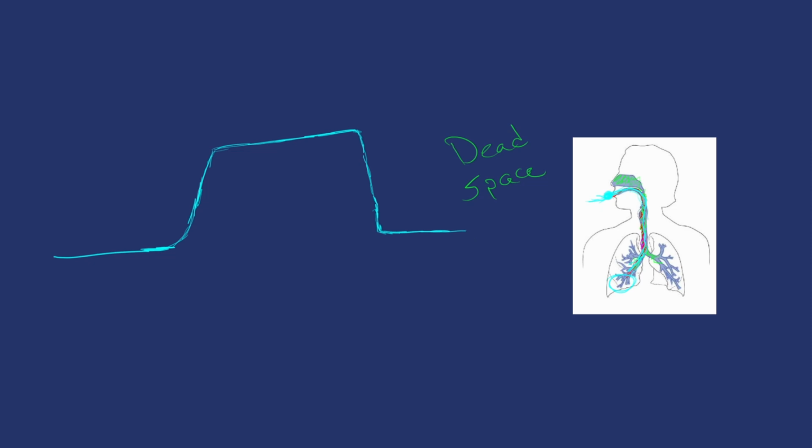So now we can go and step through that respiratory cycle and start labeling this wave for what each part represents. So remember, we had our initial baseline when we're breathing in, and that's going to be stage 1 right here, this first little line. So right here, and we'll just call this baseline. Okay, when nothing is happening or we're breathing in. Eventually we get to that expiration. So we're starting to breathe out. And again, we have that trickle, so it takes a little bit. There is that lag effect.